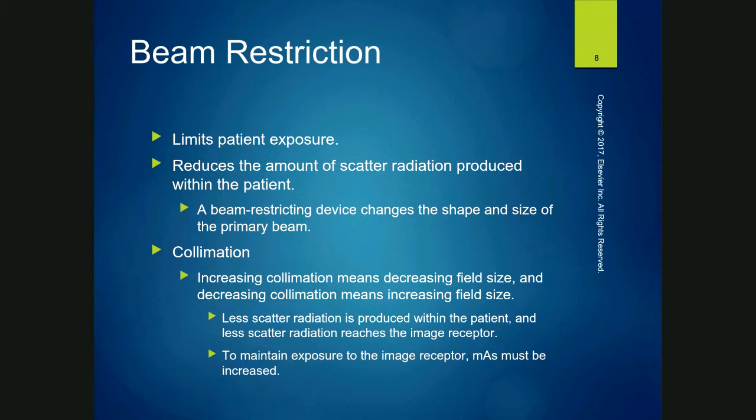I hope you guys can see me when I'm doing my hands. Anyways, field size. If you use a smaller field size, you have less exposure to your IR.